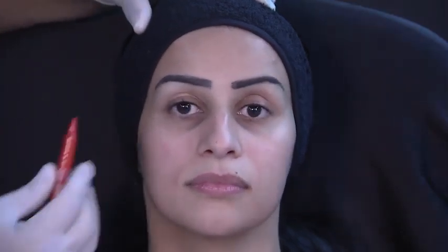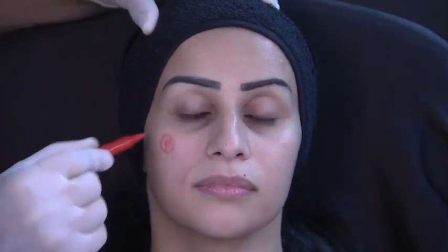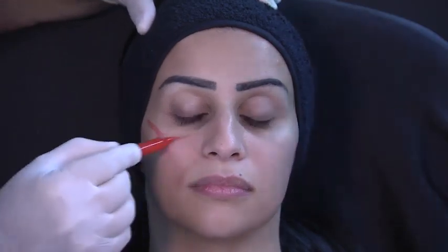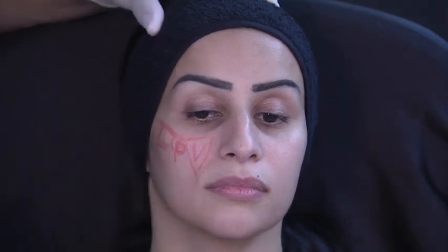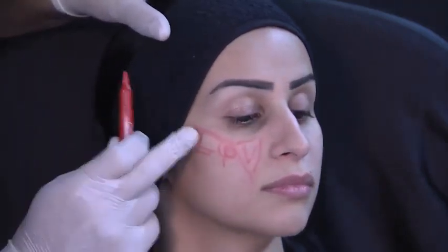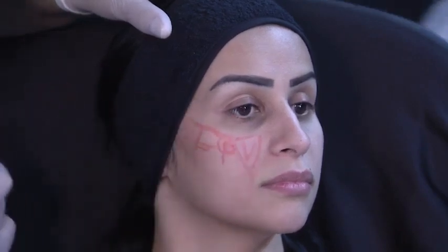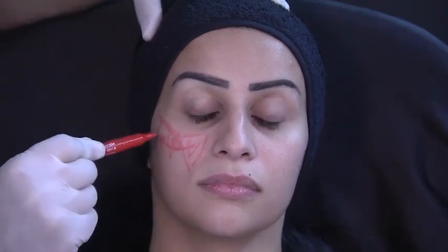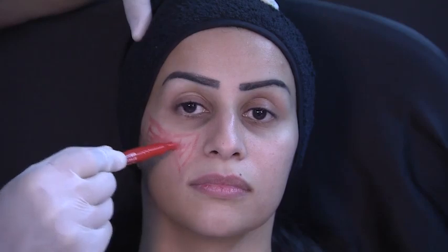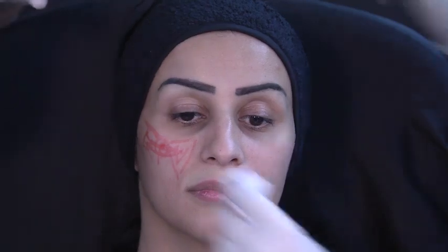Now, the priority here is to project, so this is going to be the area of projection. This is going to be the area of lifting, and this is going to be the area of voluminization. Volume, projection, and lifting. As we have seen with the holotome, we lift from here, we project the zygoma, and we volumize the malar region and the fat pads, right? So I started medial to lateral in my first patient. In this patient, I'm going to start lateral to medial, and she will need more product lateral and in the zygoma than in the medial part, okay?